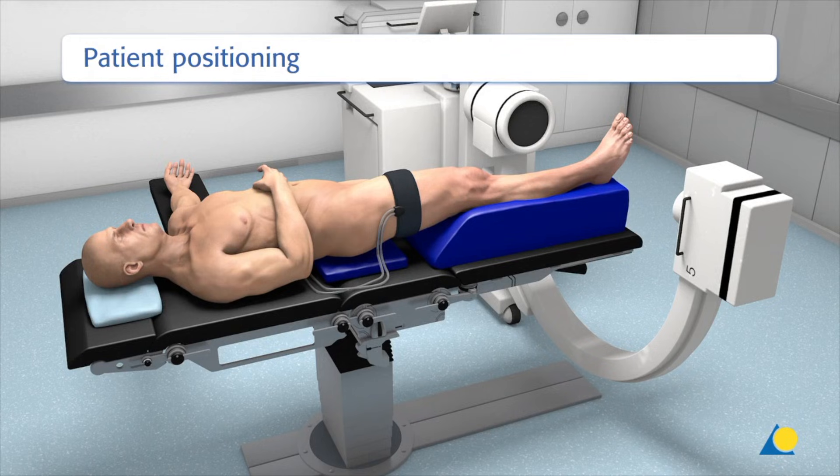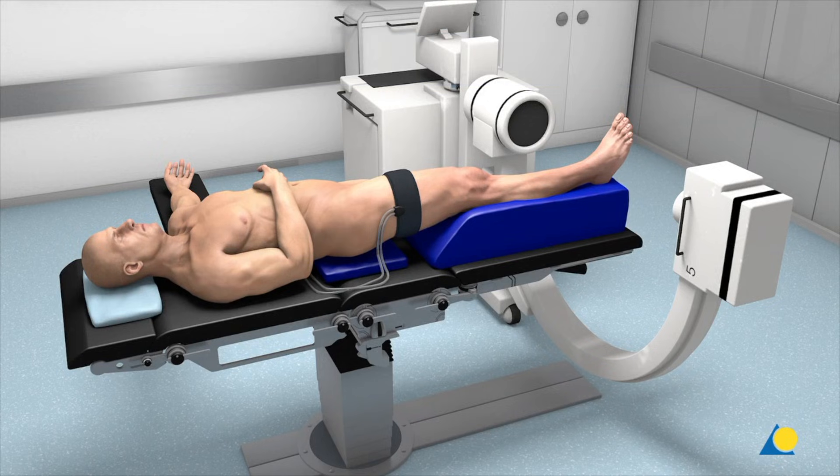The patient is placed in the supine position with a pad under the buttock to slightly rotate the leg internally. The leg is elevated or placed on a square cushion. A tourniquet is always applied but inflated at the surgeon's discretion. Potentially wound healing could be safer if this surgery was done without a tourniquet.